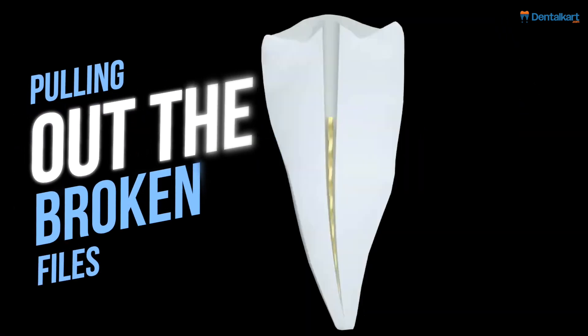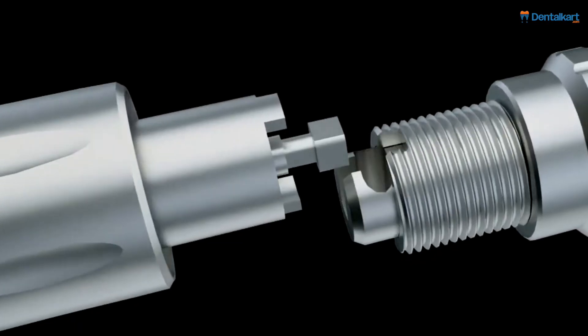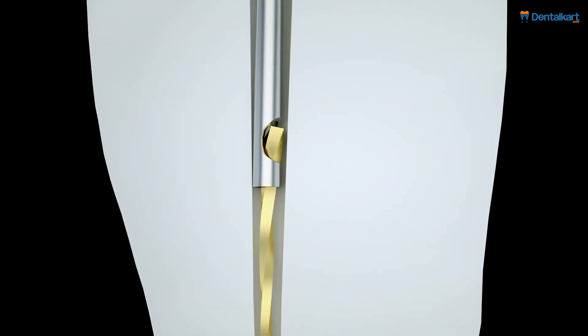To pull out the broken file: select a needle cannula and bend the working part to the required angle with a wrench. Attach the cannula to the extractor handpiece, insert the cannula into the root canal, then press the push cap to clamp the broken file and pull it out.